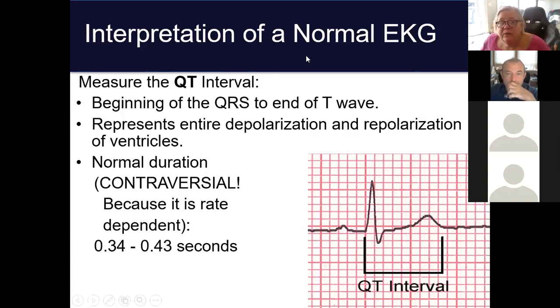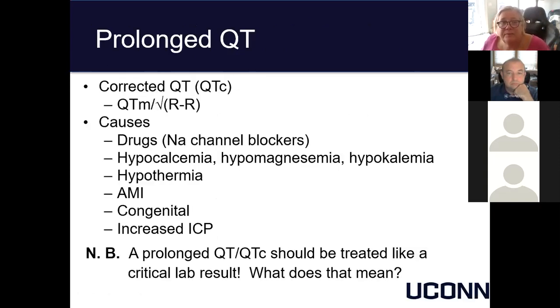But just be aware that all things being equal, prolonged QT intervals can be a potential risk for either ventricular tachycardia or ventricular fibrillation, and there are many medications that can impact the QT intervals. So as I said, there's the correction. You can try figuring that out, but to me, that's where 12 lead EKG analysis has been very helpful.